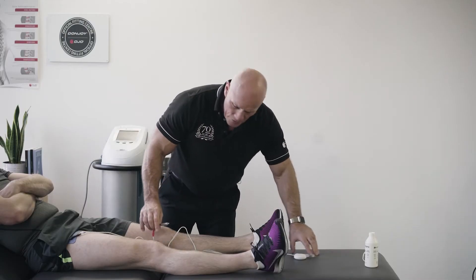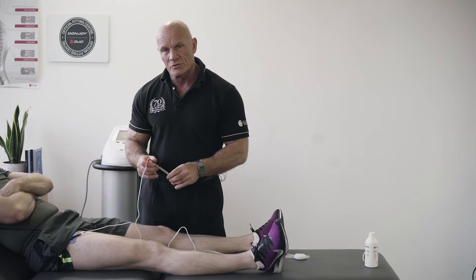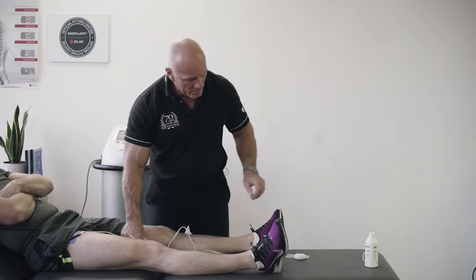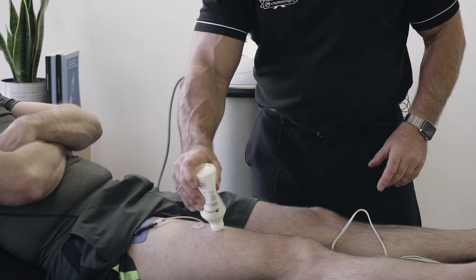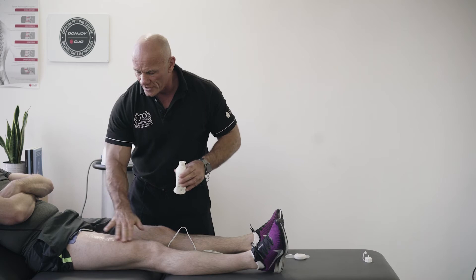The electrodes we use have a water-based gel in order to allow the impulse to travel through this very resistant material called skin. To help our impulse with the motor point pen, we just cover the muscle we want to look at in a water-based gel.